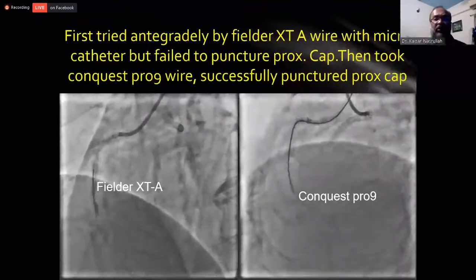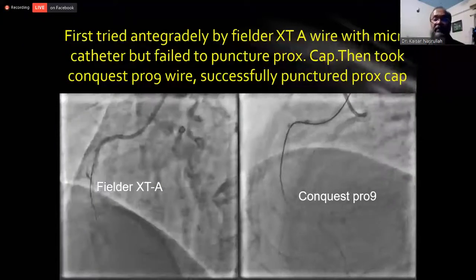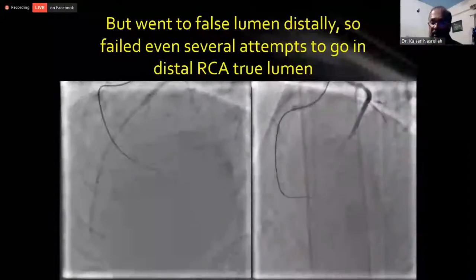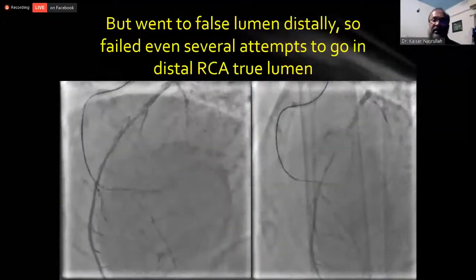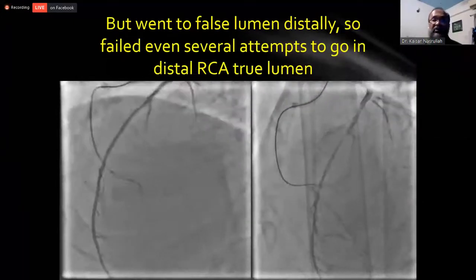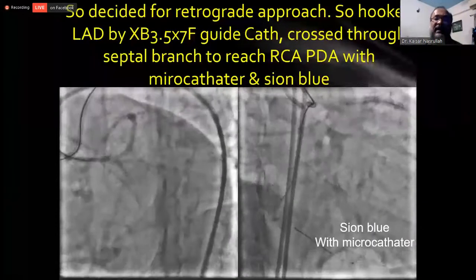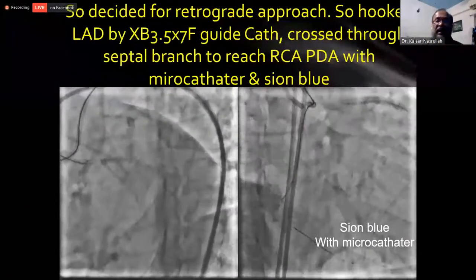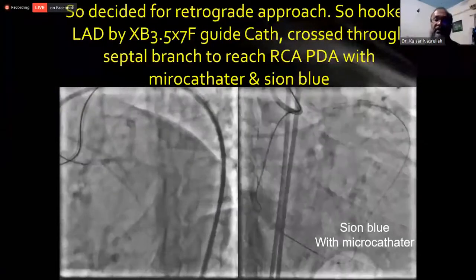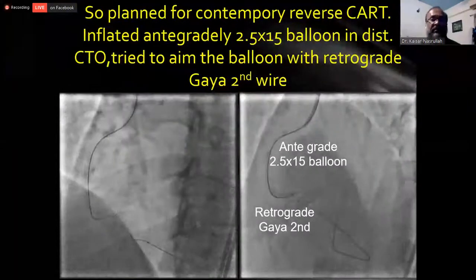Then I took a Conquest Pro 9 wire, successfully punctured the proximal cap, but went distally in the false lumen. Even after trying several attempts, I couldn't reach the distal true lumen. So I decided on the retrograde approach, hooked the LAD with an XB 7 French guide catheter, crossed through the septal branch to the RCA PDA with a microcatheter and Sion wire, and so planned for contemporary reverse CART.